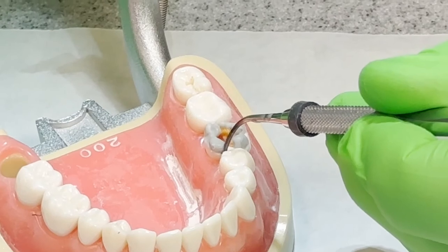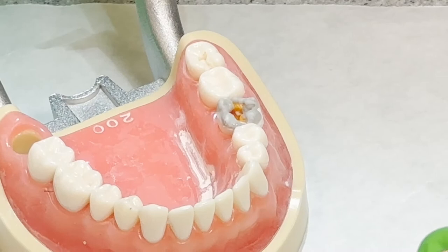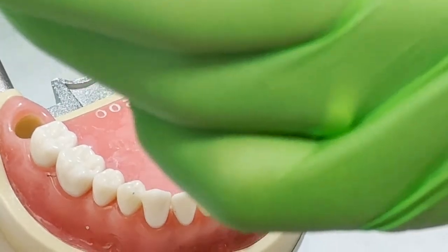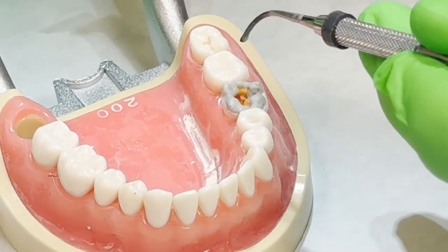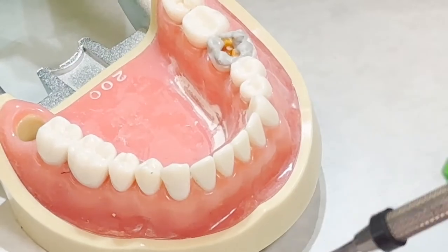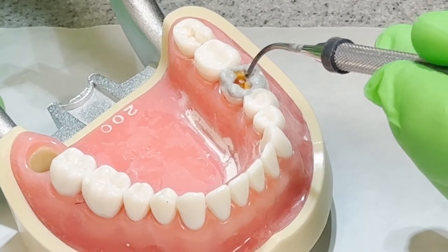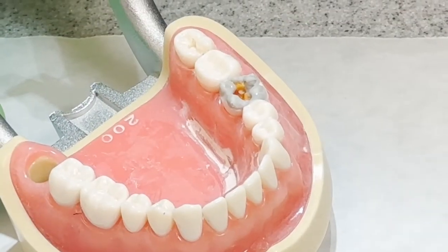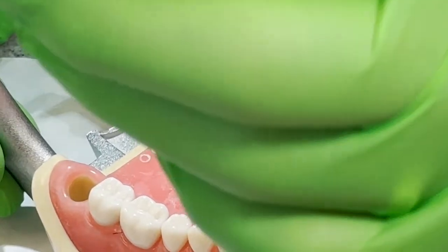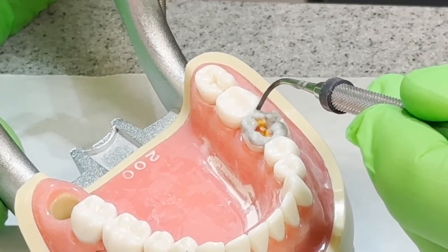And like I say, one of the main concerns we have is that you don't come out to the full length. These teeth have got a contact on the mesial and the distal, okay? Now I can carve back some of that where it's touching on the mesial, so I'm not too concerned about it. I want to make sure all of my base on my typodont tooth is covered, okay? Don't leave any voids along that edge.